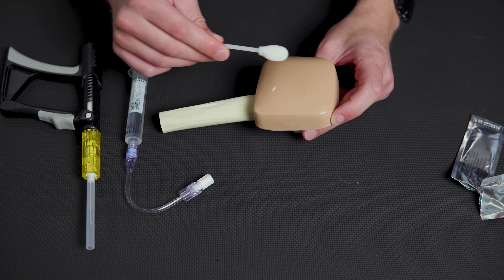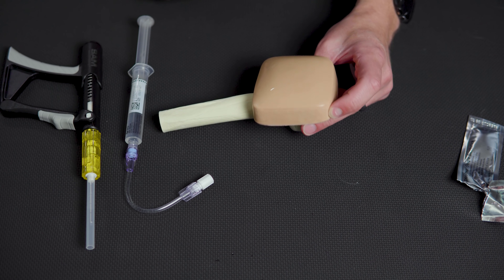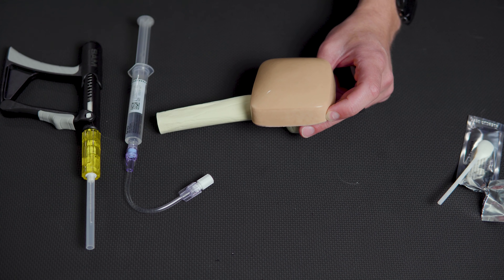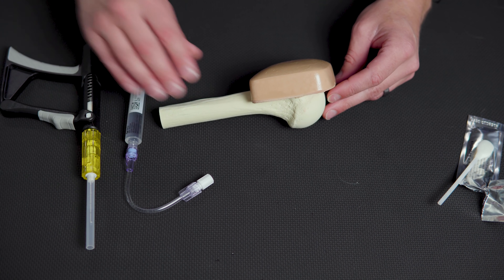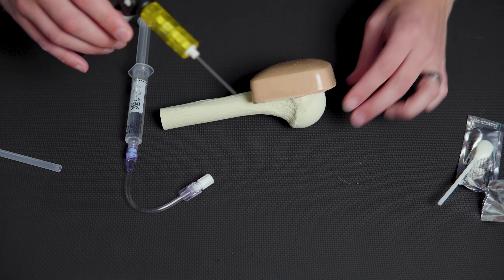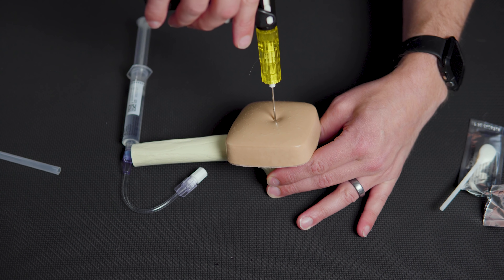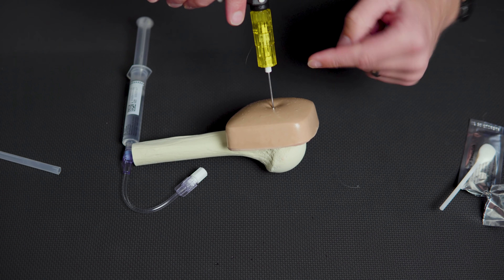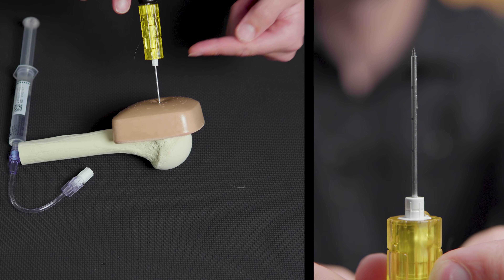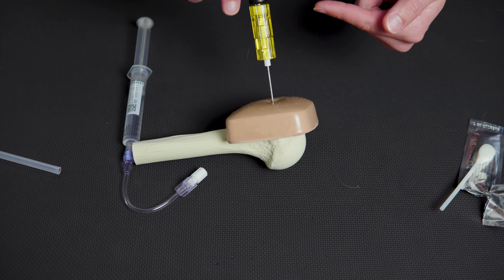Clean the site following your agency's aseptic technique — starting in the middle and working outward for about 30 seconds — and let it dry. If the patient is conscious, this prevents additional stinging during the procedure. Then take the needle and driver, confirm it's functioning, remove the cover, come to the skin directly over the site, and insert it all the way to the bone before actuating the device. Confirm that the last black five-millimeter mark is still exposed above the skin. If it's buried to the hub, you need to go up one needle size.